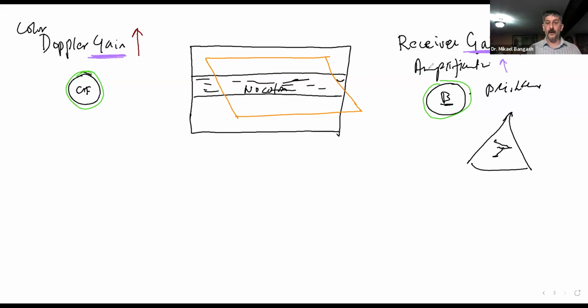How? Mainly because the intensity, or the amplitude or the power of the reflections from the tissues were increased. And I may call that, yes, the image will become brighter. So the same is going to happen here to what shall be demonstrated by color.